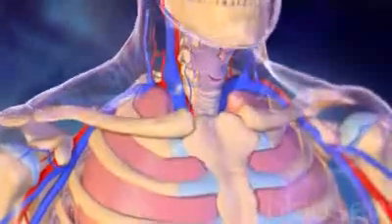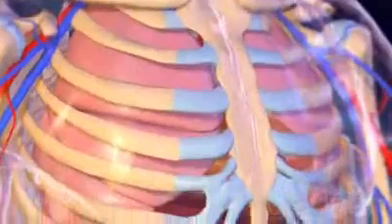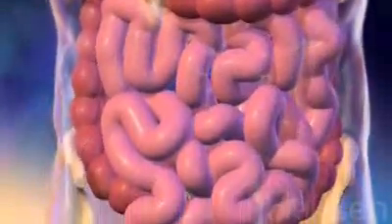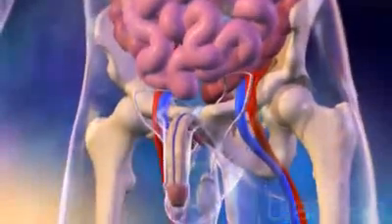Endoscopic biopsy is performed during endoscopy. Endoscopy is a type of procedure that allows the physician to view the body internally without having to perform an operation.